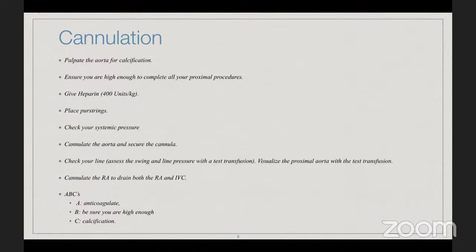Professor, if you allow me to answer your question. Yes. Actually, both of what's mentioned is being done. Maybe it's done by the perfusionist without you knowing about it. Usually, they first test the pressure only, before giving any transfusion. He's just looking at his arterial line pressure and comparing it to the systemic pressure. If it's acceptable, within 20 and there is not much of a difference, then he will do the volume test.